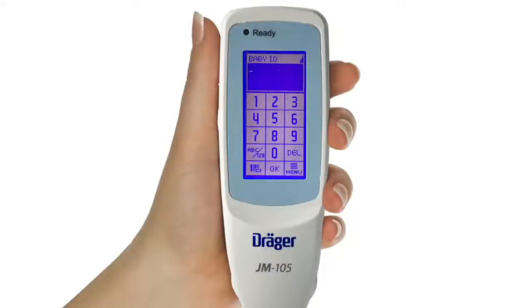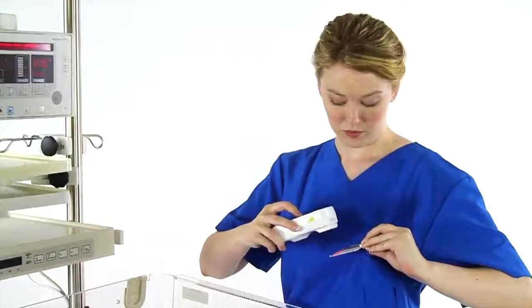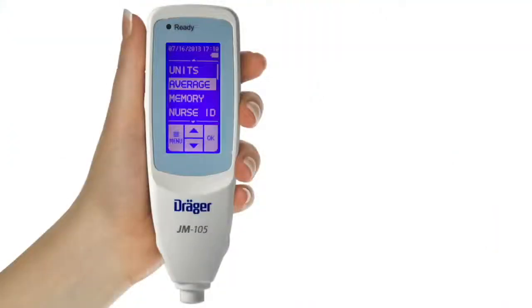You can also decide whether you want to enter ID numbers or letters on an alphanumeric keypad, or scan a barcoded ID band or nurse's badge. First, from the configuration screen, scroll down and highlight Nurse ID. You can choose between None, Barcode, and Touch. The default setting on a new JM105 is None.